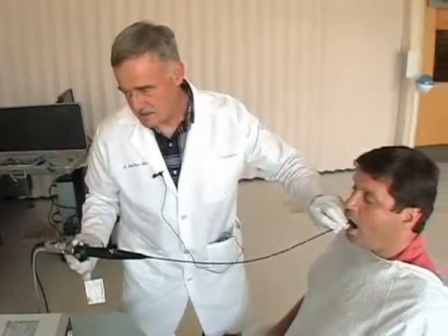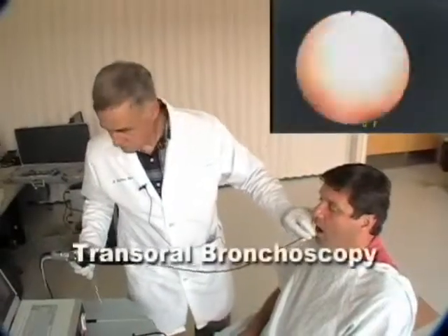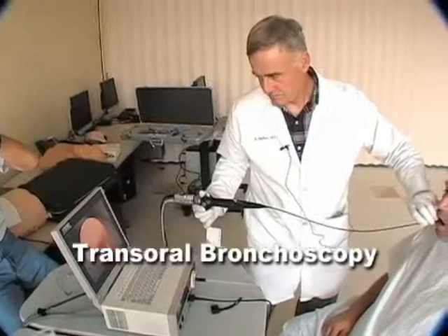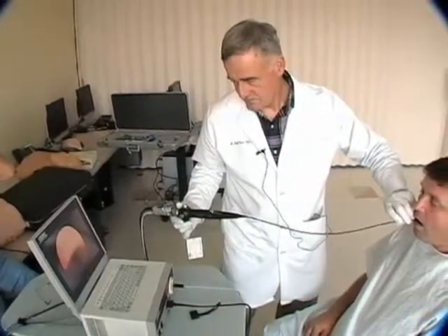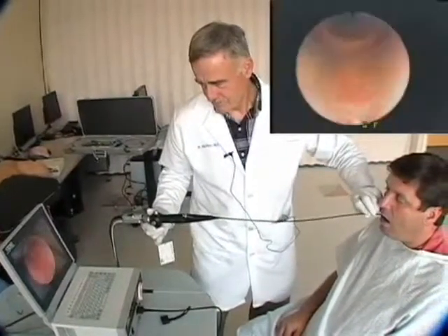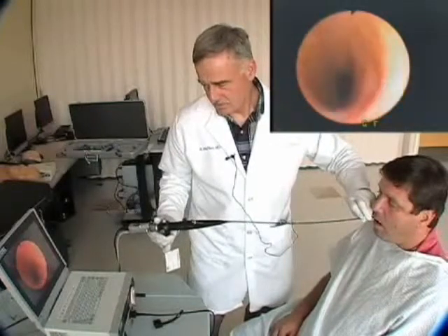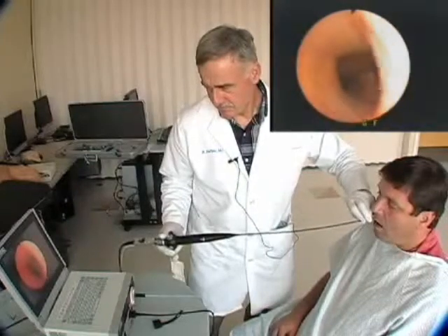Say E. That's the uvula. There we are — going all the way down. Here we go, here it is right there.